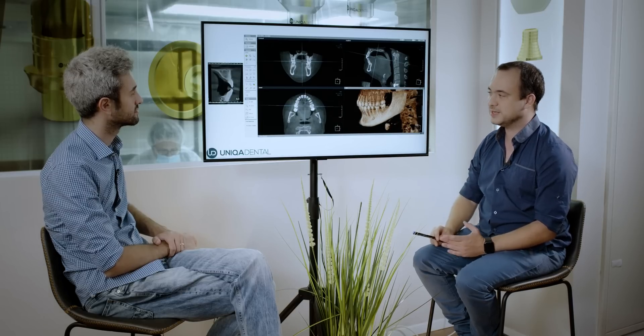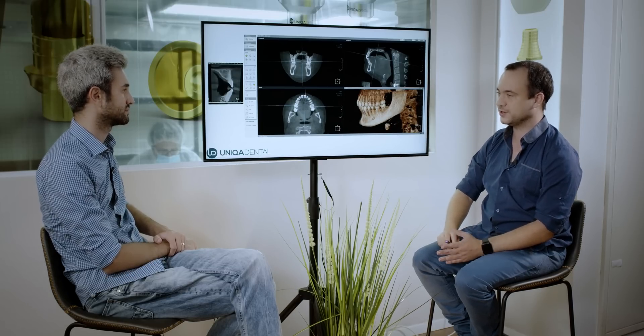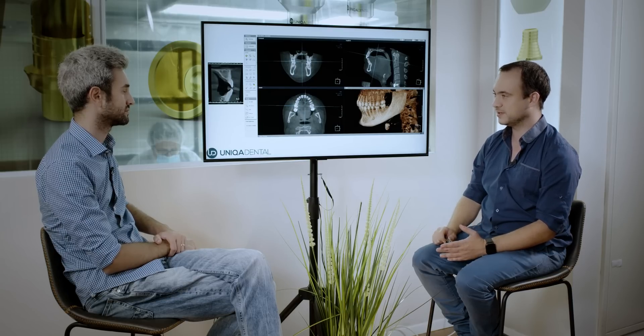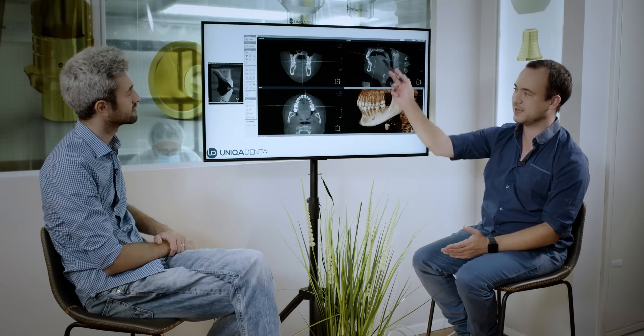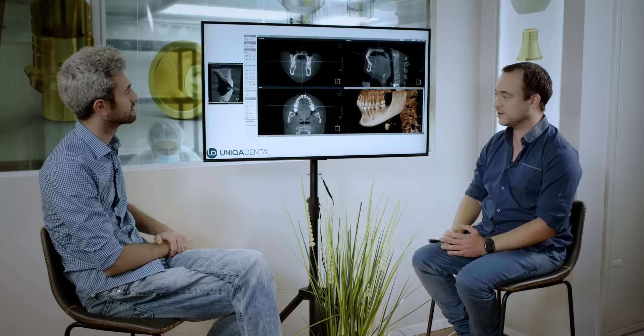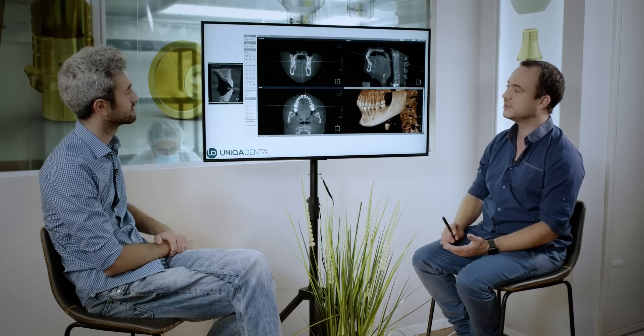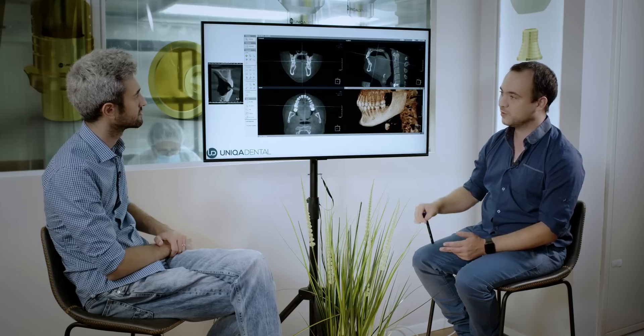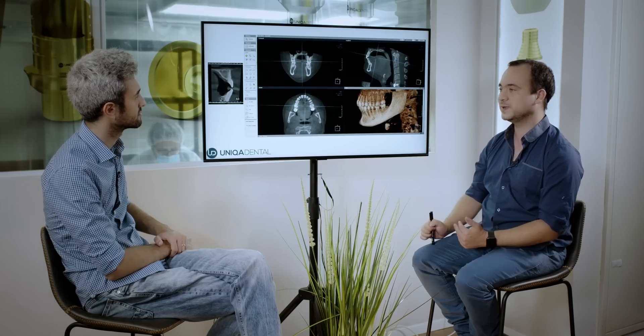For example, the sinuses. In the horizontal part, it gives me less information because I don't need to measure anything in the horizontal slice. But these two vertical slices are used in most of the cases. However they're not enough, because if I want to put an implant not in the back area or the front area, the slices will give me not a straight cut of the jaw. I need a perpendicular cut for every place in the jaw where I want to place the implants.